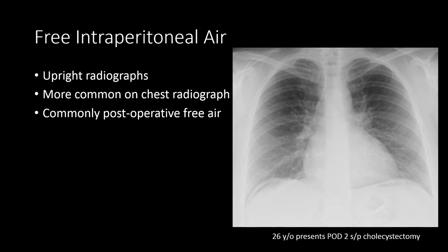When you see gas between the hemidiaphragm and the liver, you can be confident that that's air in the abdomen. Most often we see post-operative free air, and it can be incidentally detected on radiographs. Here you can see free air highlighted by the three yellow arrows under both the right and left hemidiaphragms.